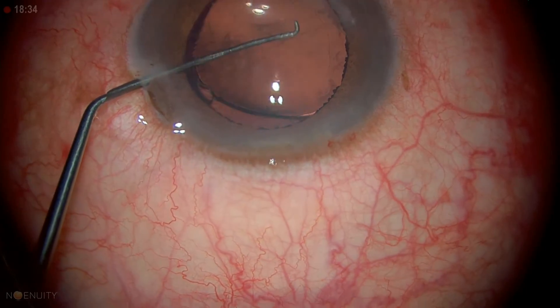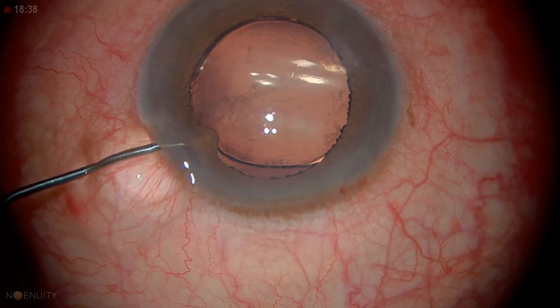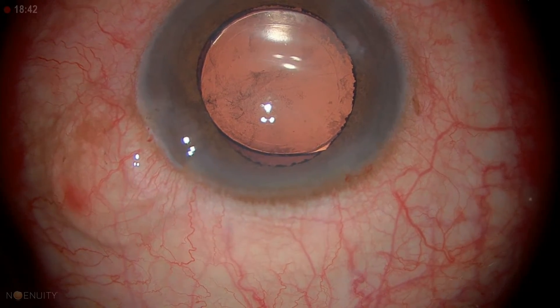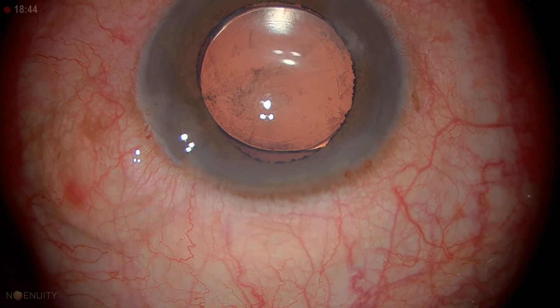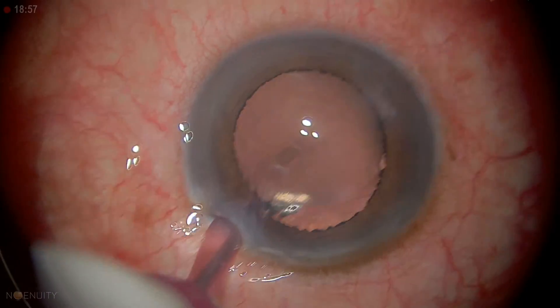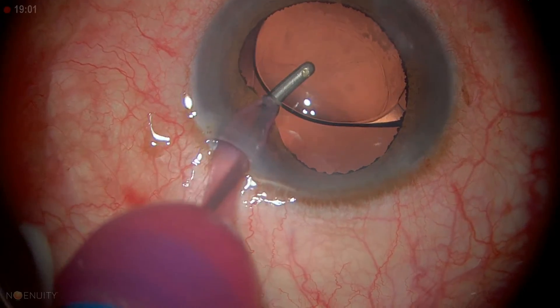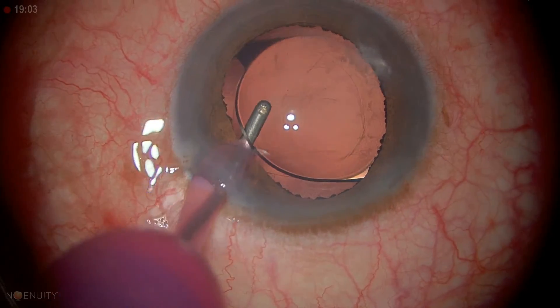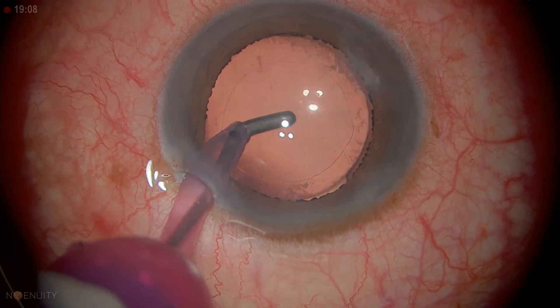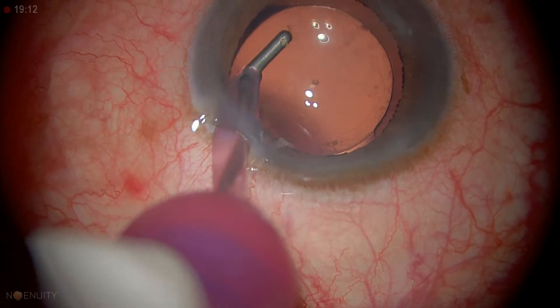We've got the lens in the bag. We've got a little iris to the wound, so I'm going to let a little visco out to control that, then go back to the I/A. I have a little bit of debris under the lens — I'm going to lift the lens up just to get rid of some of that, then hold it down to get all the viscoelastic out from the bag.